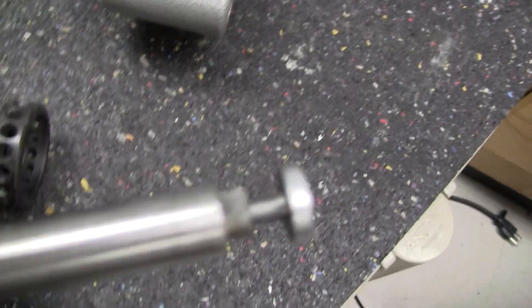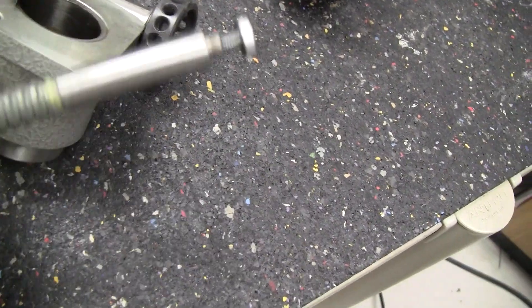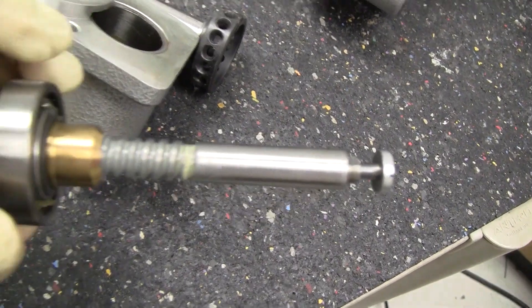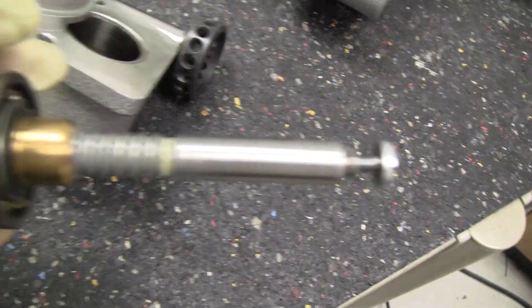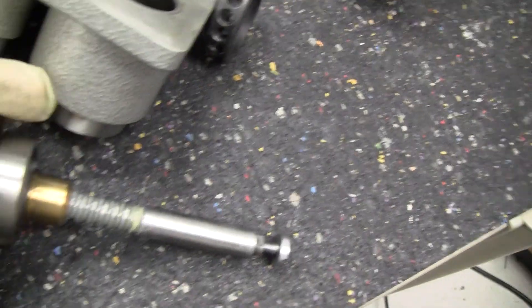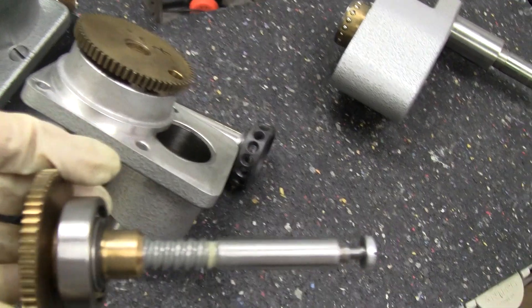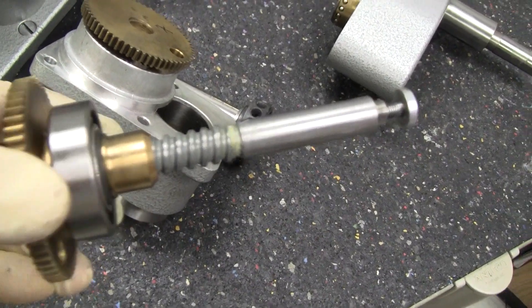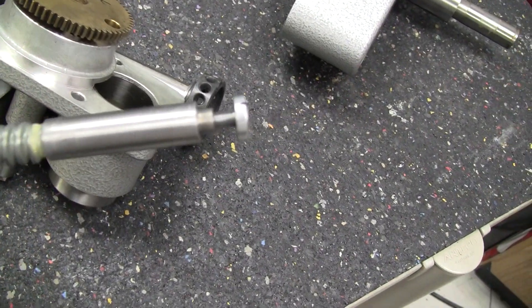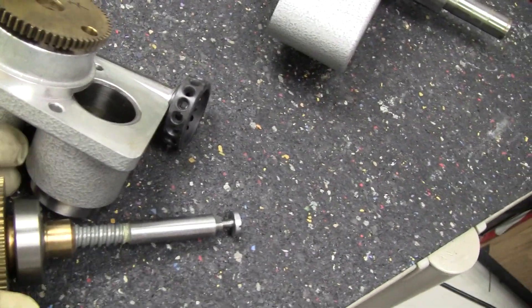If not, then you can only get to so much of the spindle shaft. But I took the spindle shaft out, cleaned it, and then re-greased it.